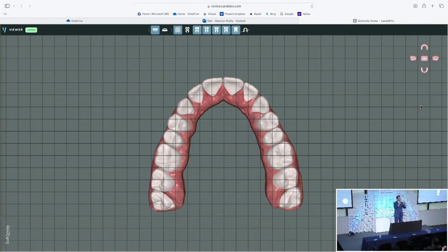So all of a sudden you can have all of this beautiful uprighting and spread that all out. Her smile's improving. She's moving in the right direction. In the end, you'll have 32 teeth there to show for it. It's a very nice opportunity to use your treatment plan with the grid to see where you are starting, where you are ending. You can see the arch form easy. From V to beautiful dome, easy. The uprighting, you look at this and it goes like that. And then of course in the smile it shows too. So you get to watch all that through.